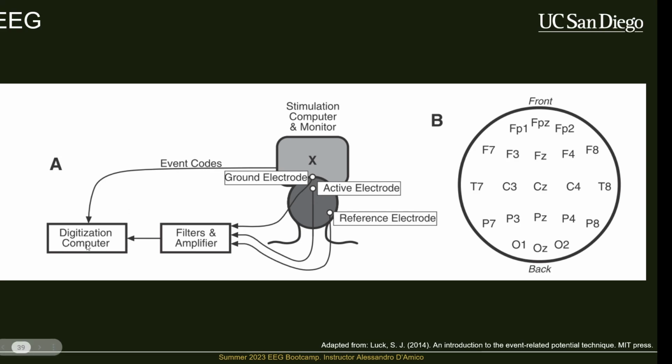The reason why you need to increase these signals is because digital computers have a certain finite range of signals that they can pick up, right? Although we're recording analog signals here and they stay analog as they're being amplified, we need to turn them into some signals that we can send to our actual computer in order to load them into analysis software. And what we're doing is we're essentially taking these analog signals and converting them through a process called analog to digital conversion. There's a bunch of different ways to do this. It's like a generalized process. But one of the things is you need those signals to be large enough for the ADC to recognize. That's why amplification is important.